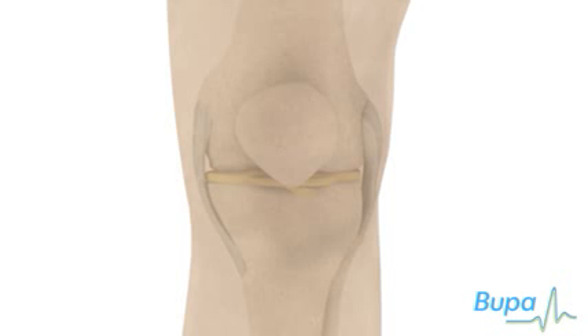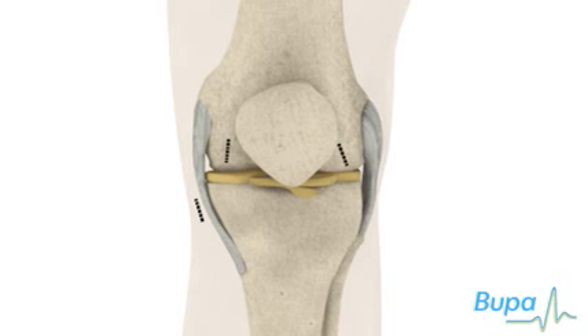Once the anaesthetic has taken effect, small incisions will be made in the knee area. Sterile fluid will be pumped into the knee joint through the first incision. This expands the joint to help produce a clearer picture for the surgeon.